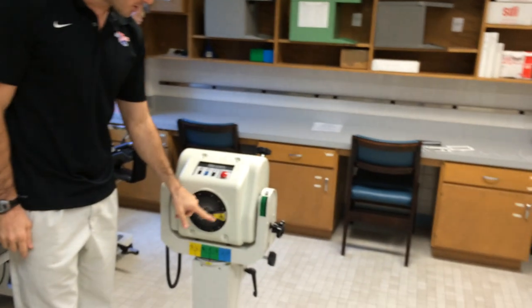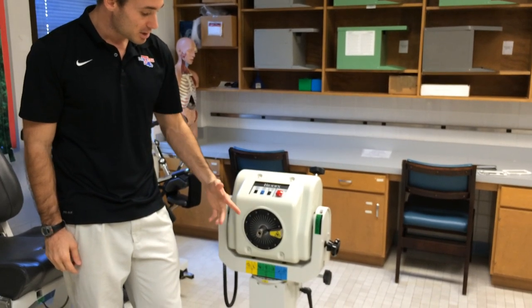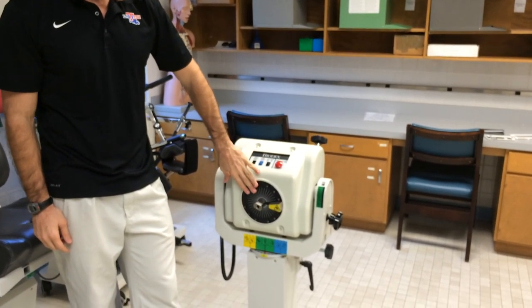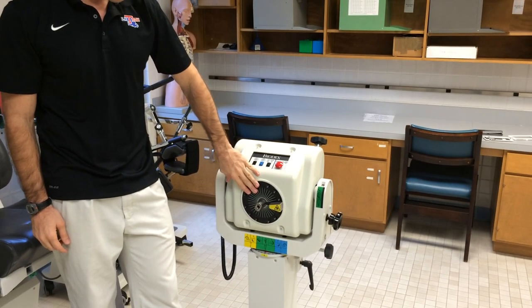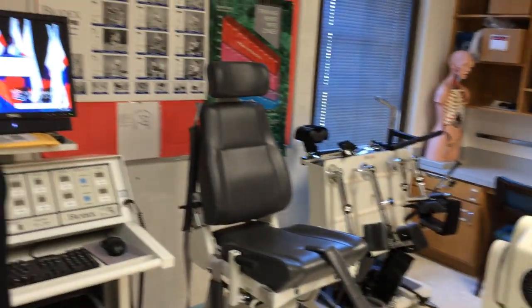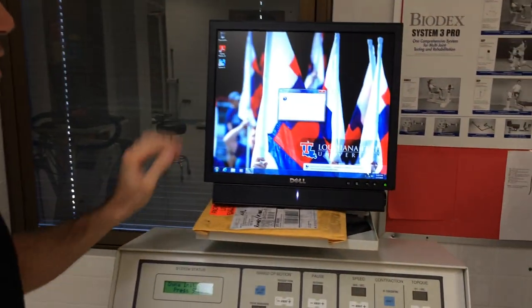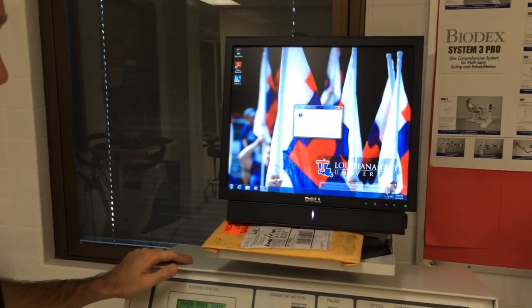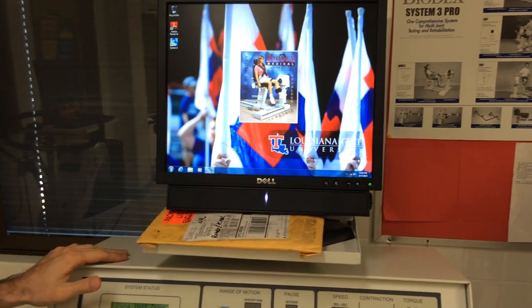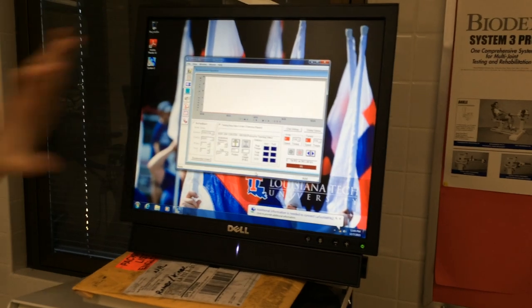We hit that button, and after that, we start to see this knob turn on the dynamometer. This means that the piece of the equipment's actually calibrating, it's initializing. Once this is done turning, we can move forward. There it goes. It only takes a few seconds. Once it's done turning, we come back to our computer. We can hit OK to continue, and then we'll see retry connection to the dynamometer. We want to do that as well. As long as we've done these steps properly, it will automatically bring up the software.